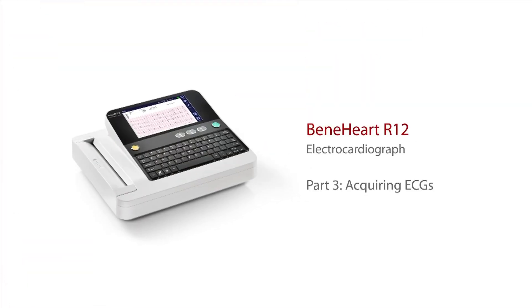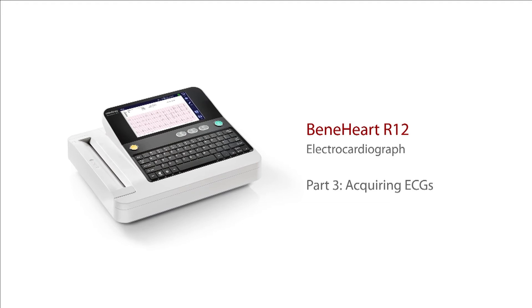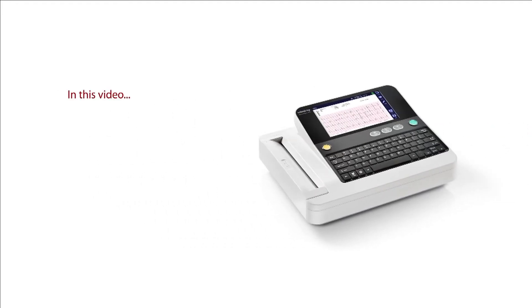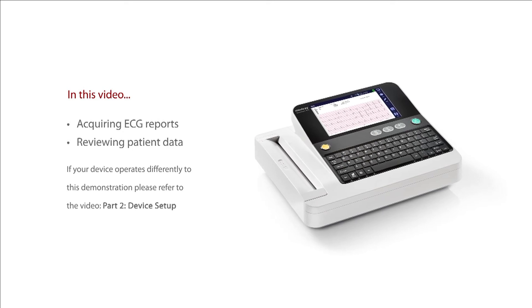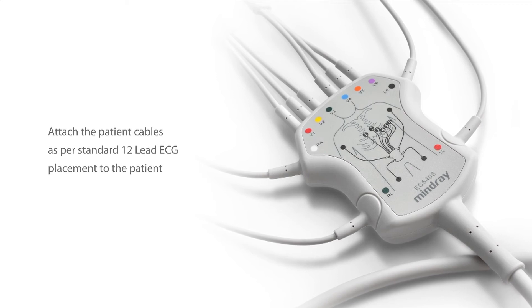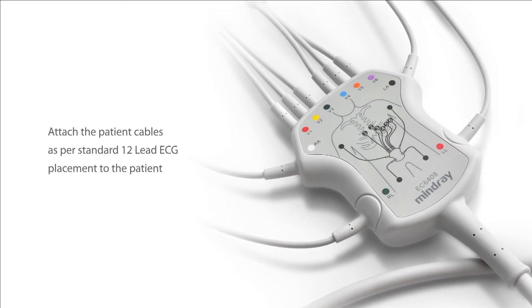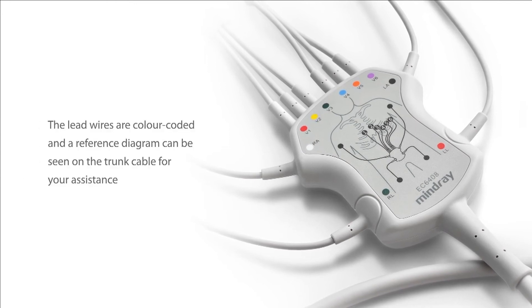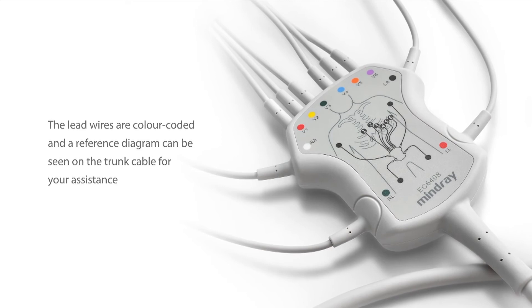Welcome to part 3 of this clinical user training series for the Mindray R12 electrocardiograph. This video will explain how to acquire ECG reports and review patient data. Attach the patient cables as per standard 12-lead ECG placement to the patient. The lead wires are colour-coded and a reference diagram can be seen on the trunk cable for your assistance.